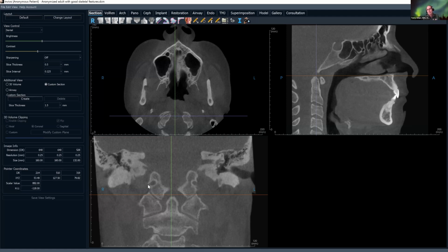It took me a long time. I kept hearing the eagle view for a long time, and some of you may be familiar with that. I've always wondered, well, what is that? It took me a while to figure this out. This is where the hypoglossal passes through. And so the eagle sign is kind of like an eagle's beak in profile.